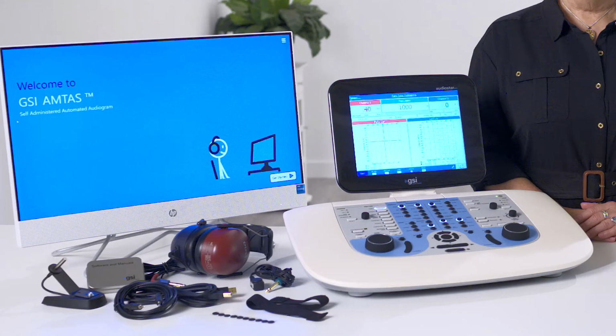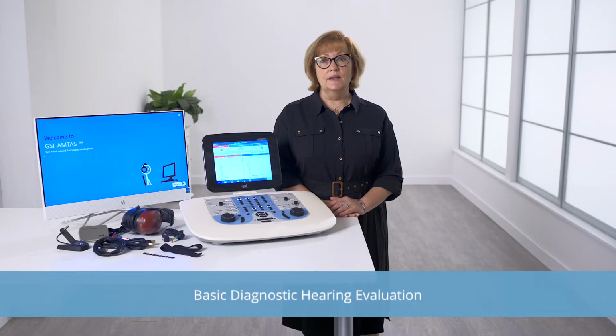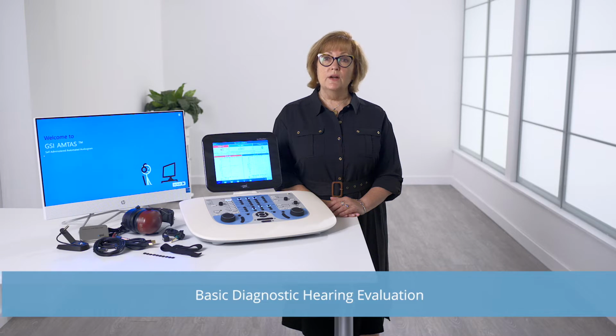GSI AMTAS Pro is a software program that is connected to a GSI audiometer. The AMTAS Pro software allows a patient to interact with the computer to complete a basic diagnostic hearing evaluation. AMTAS uses the calibrated audiometer and transducers along with years of research and validation to ensure the hearing test results are accurate and repeatable.